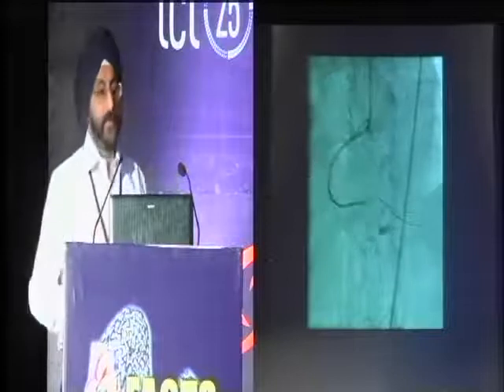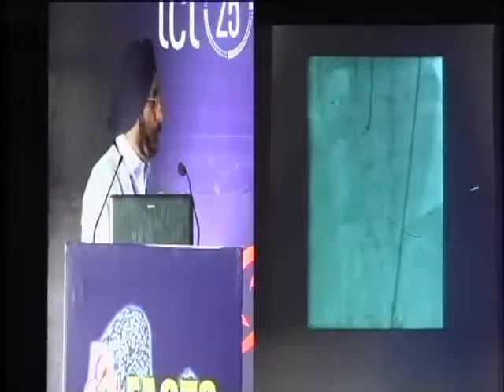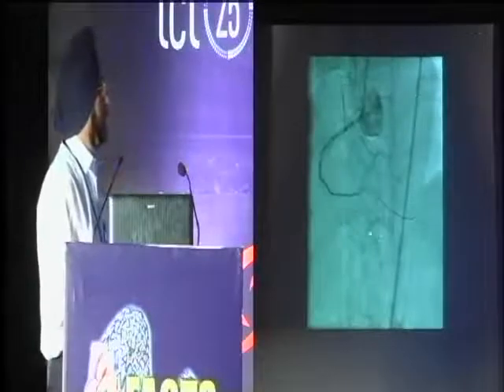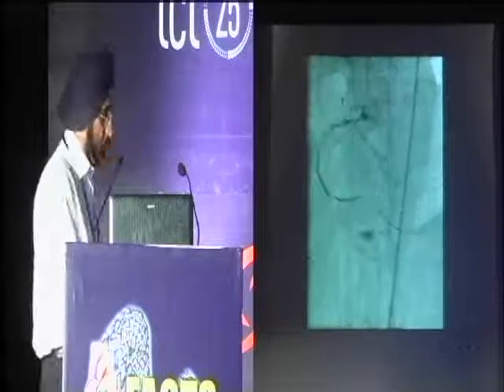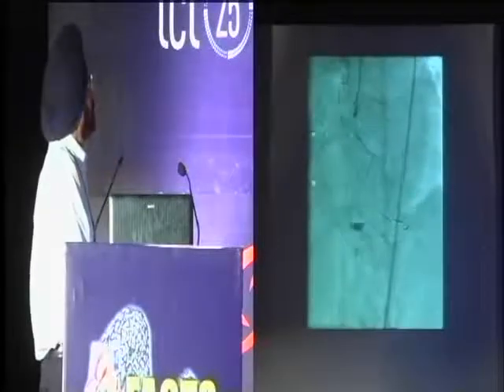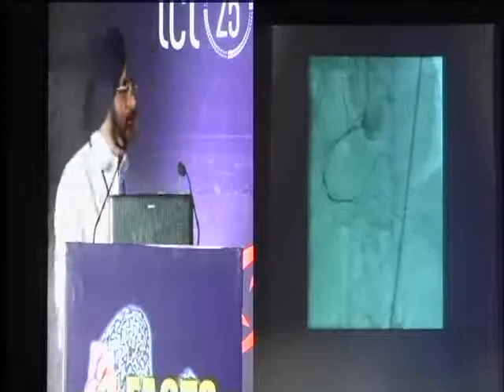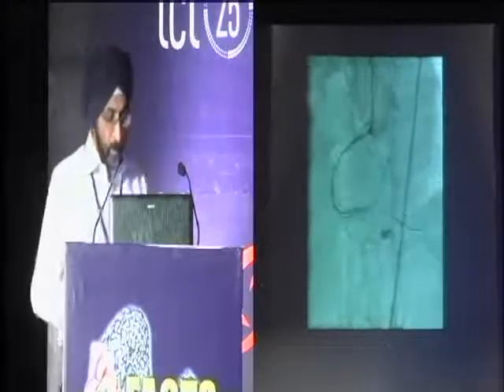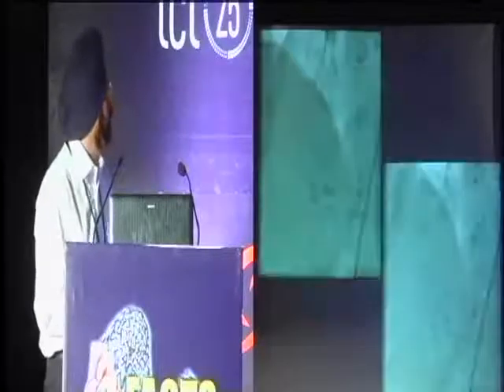There was some difficulty in withdrawing this 2.5 millimeter balloon, but once we took a shot after that, we realized that a mess had been created distally. Throughout the procedure, we were worried about this particular area, and somehow this was a mistake that we failed to see what was happening over here. I'll show later on, somehow there was a capture of videos of what exactly happened.